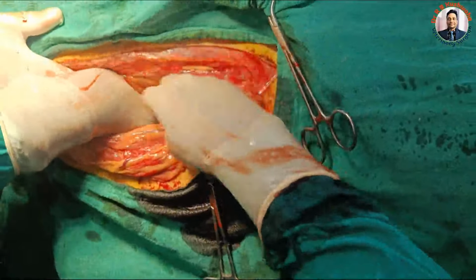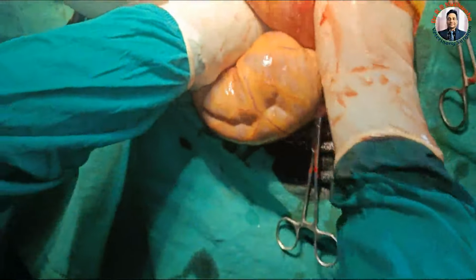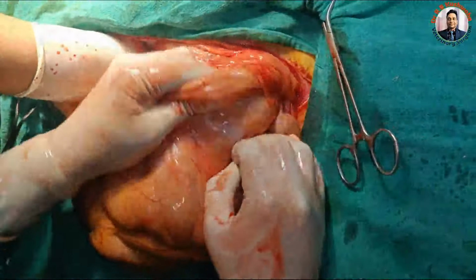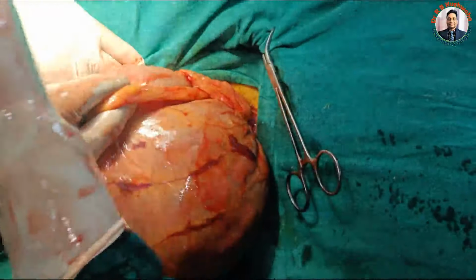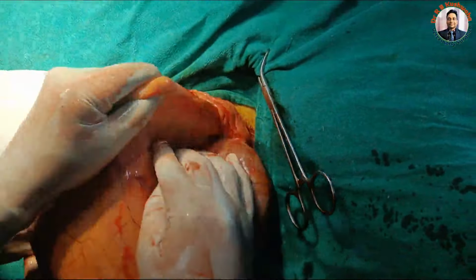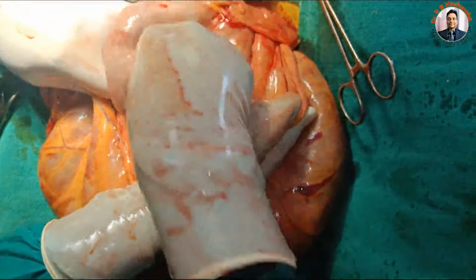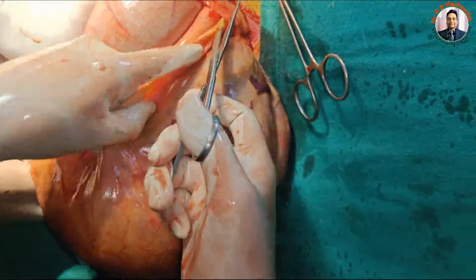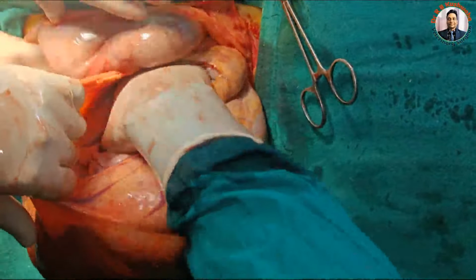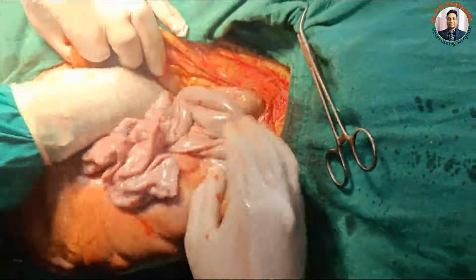We have to separate it because the omentum is over the uterus. Give the scissors. So this is the omentum. Now you could see this omentum has covered the intestine. Now you could see the intestine is coming through this incision.